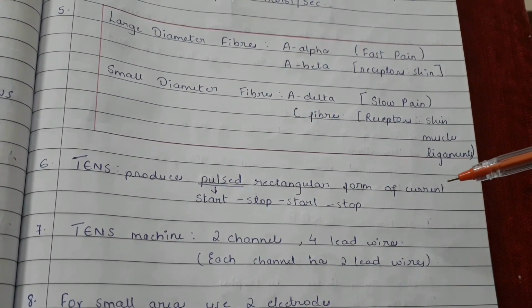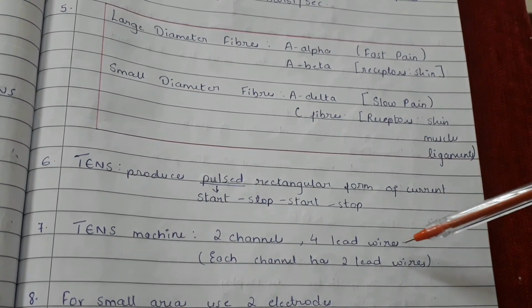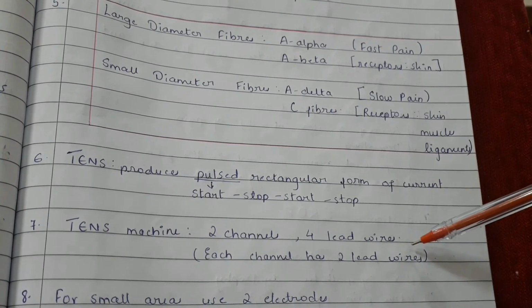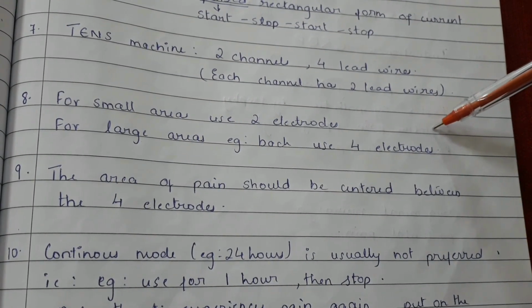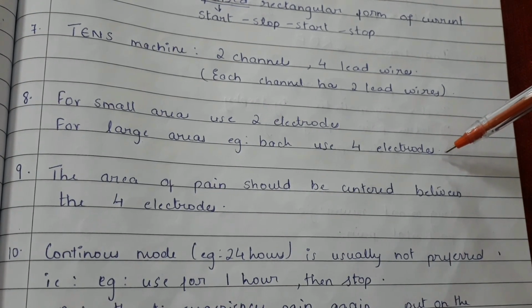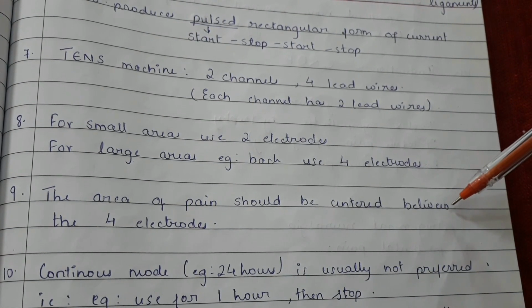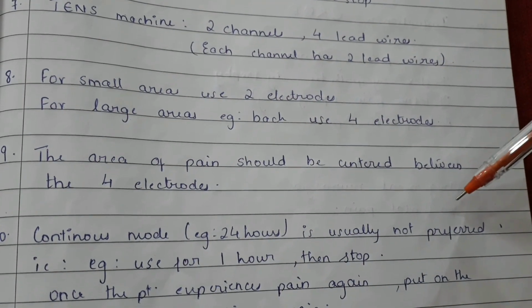TENS produces a pulsed rectangular form of current. The TENS machine has 2 channels and 4 lead wires. Each channel has 2 lead wires. For small areas, use 2 electrodes, and for large areas, for example in case of low back pain, use 4 electrodes. The area of pain should be centered between the 4 electrodes or between the 2 electrodes.